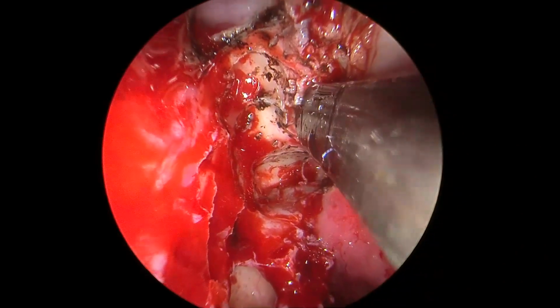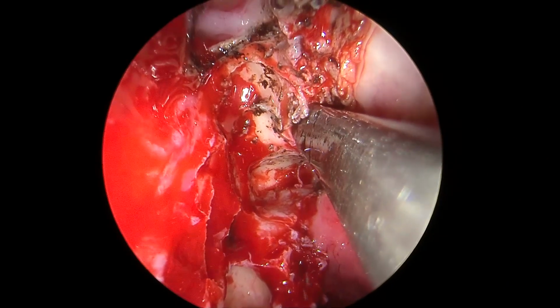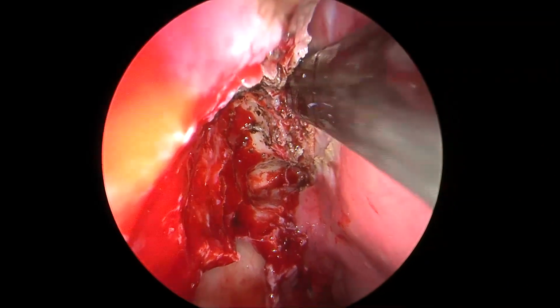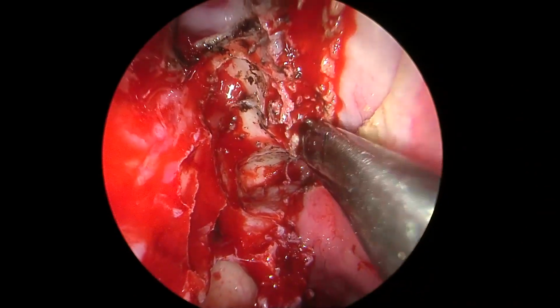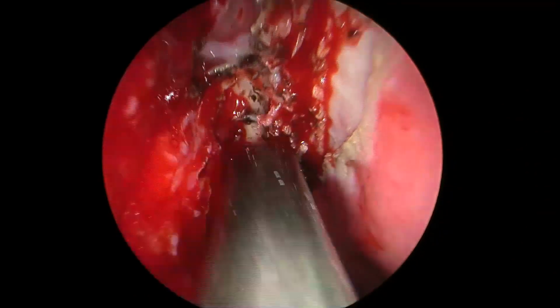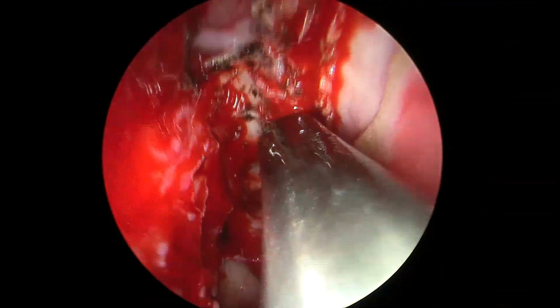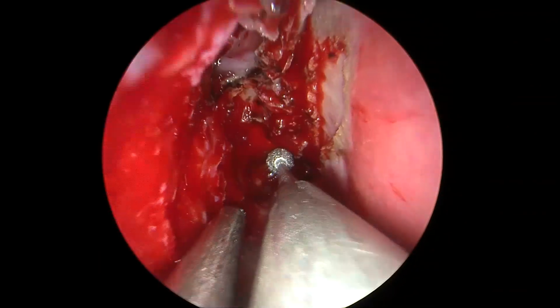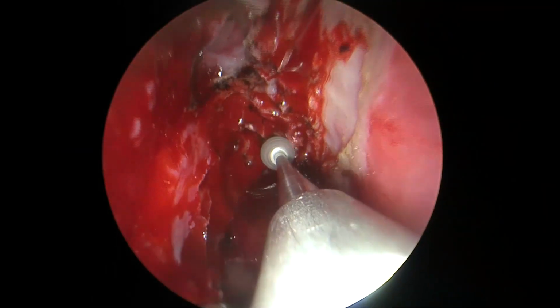One can see the anterior ethmoidal artery on the left side, anterior to the defect. Now we're using a broad elevator to palpate the defect, most importantly to isolate the bony boundaries. This seems to be the right size. Sometimes if it is too small, we need to enlarge it with punches because an extremely small defect cannot be closed. But here the defect size is reasonably okay to be closed.